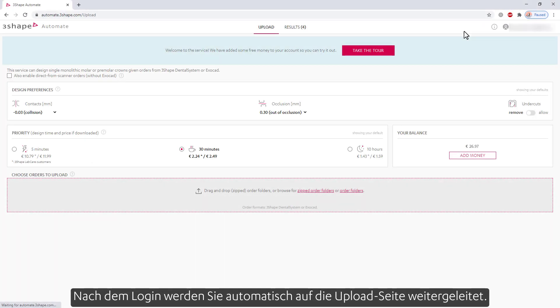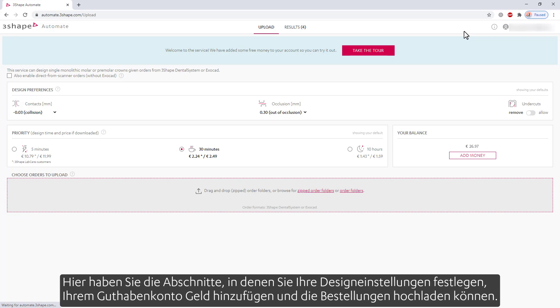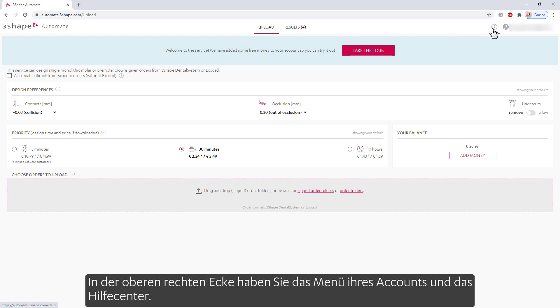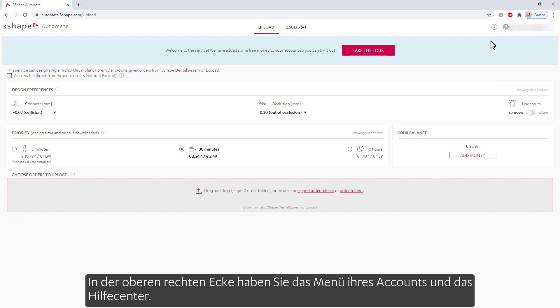After login, you are automatically taken to the upload page. Here you have the sections to set your design preferences, add funds to your balance, as well as upload the orders. In the upper right corner, you have your account menu and the help center.